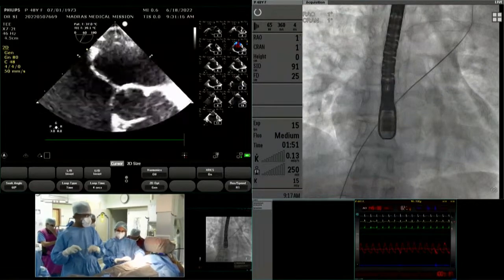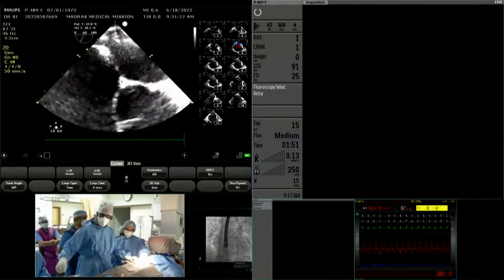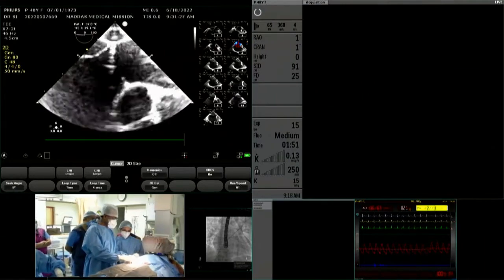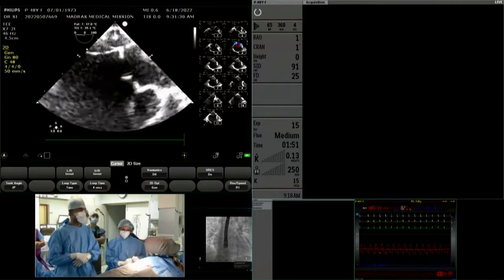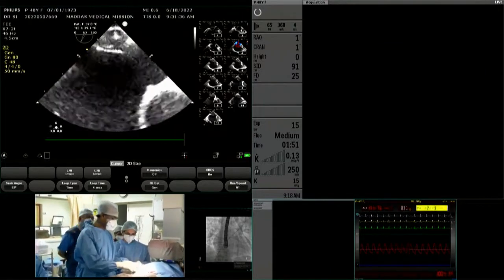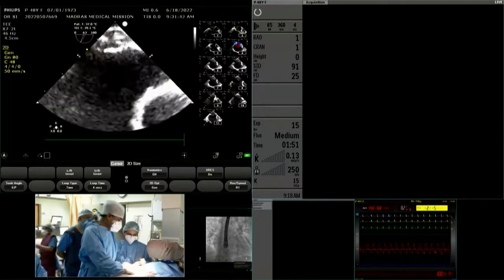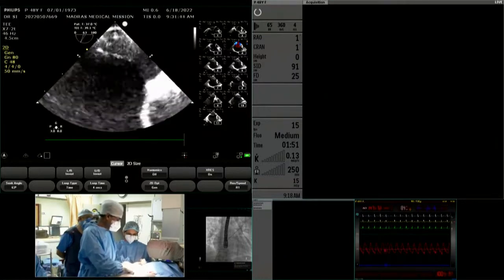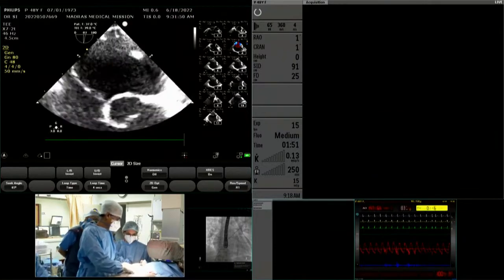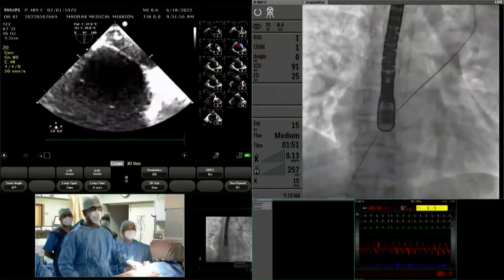In the last issue of Annals of Pediatric Cardiology, Pramod Sagar, who is doing the echocardiogram, presented our experience on multiple ASD devices in about 28 patients using two devices. He enumerated the reasons why we do a balloon sizing. Number one, when we do a balloon sizing, we are actually occluding the first defect, and we ensure that the second time we are crossing is not through the same hole, and we are crossing through the second hole. Otherwise, there are a small number of occasions where we would have assumed that the first wire is going through the first defect and the second is going through the second, but after positioning the sheath, we recognize that both are through the first.